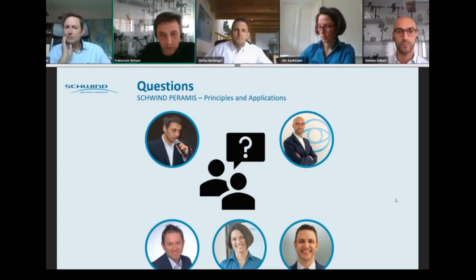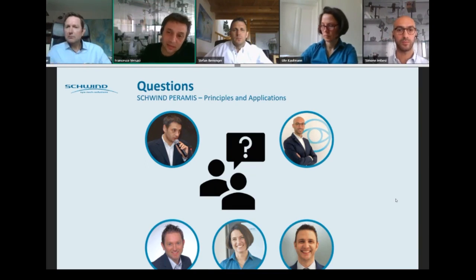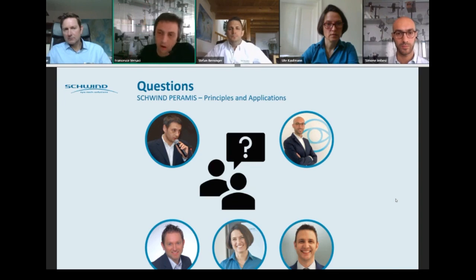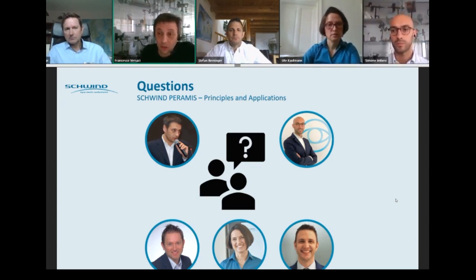So usually, what has been done by people who plan customized treatment is to select and unselect the Zernike coefficients and check what is the amount of focusing of the aberration on the PSF. So if it appears that by removing a single aberration, the PSF doesn't change that much, maybe it's not worth correcting it.